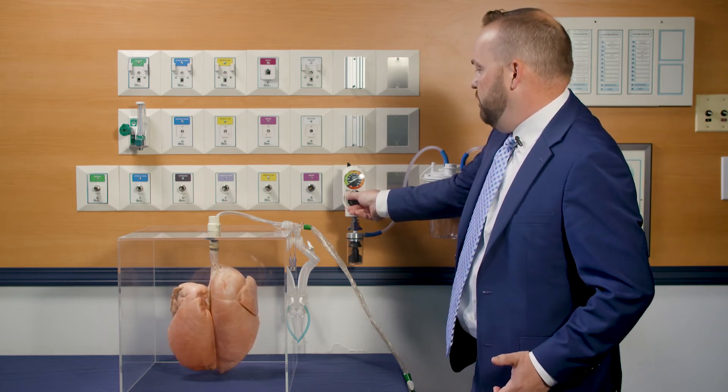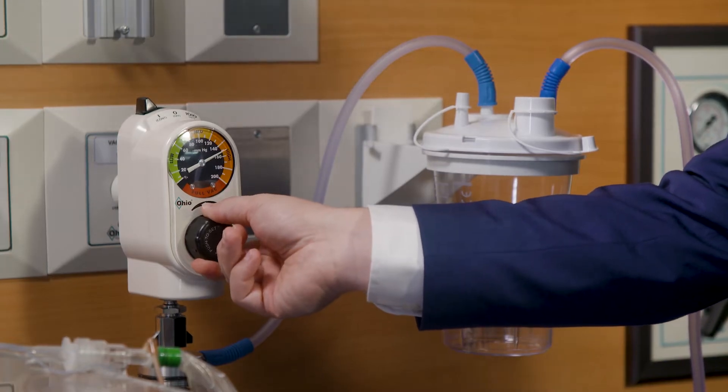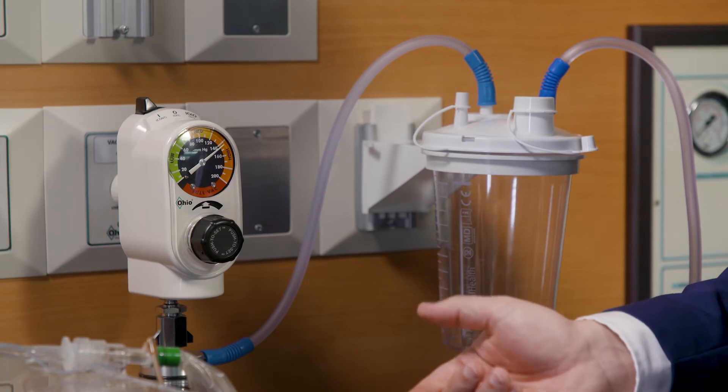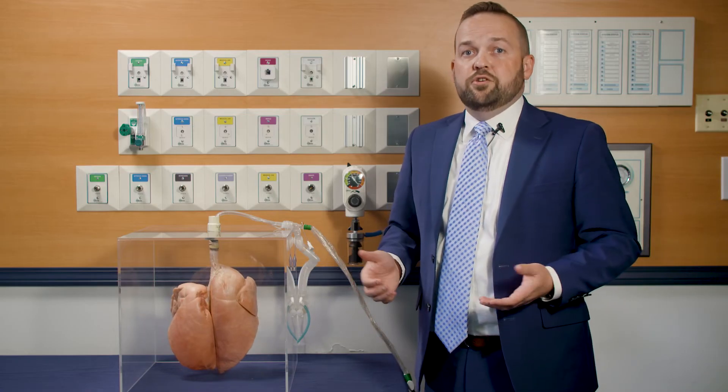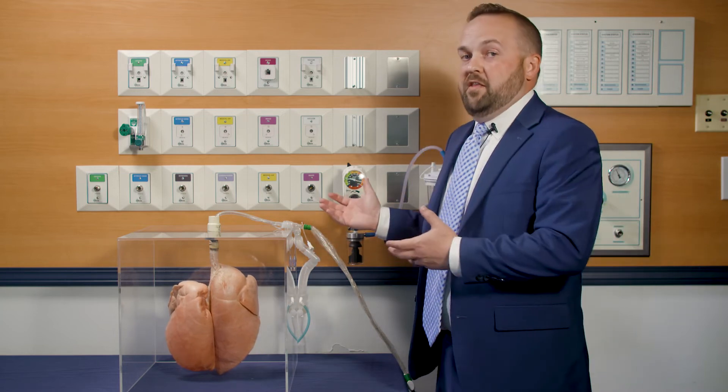As long as I have the button depressed, I can set it to 140. It takes the complete occlude-to-set procedure away and makes it a lot easier for clinicians to do that without having to move to the back of the bed.